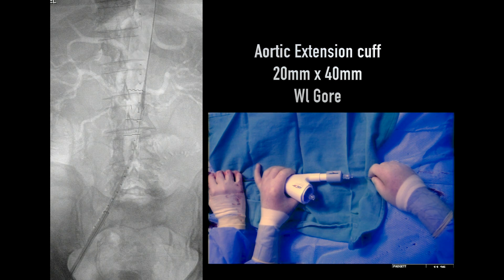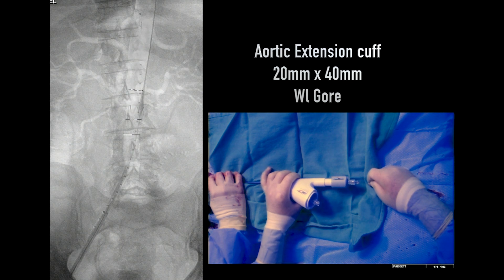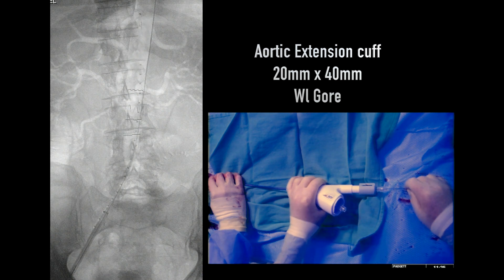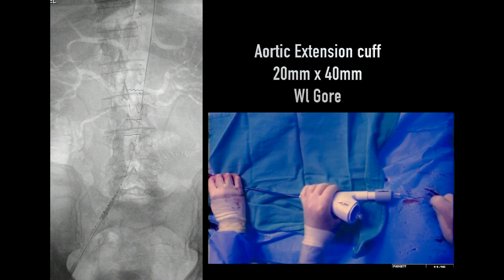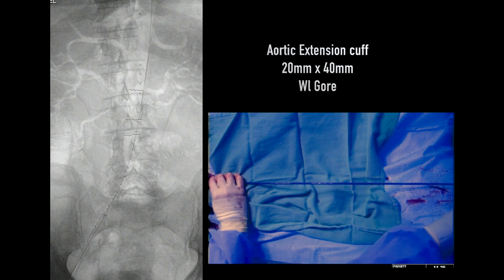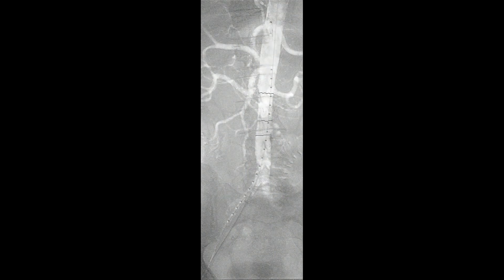We then brought in a balloon. After the delivery system is removed, we used the balloon to seal up both the proximal and distal ends, and then we straddled the origin of the aneurysm. As you'll see, the graft pouches out into the aneurysm orifice itself. The balloon is being brought up, dilating the proximal and distal end and then the center portion of the device.